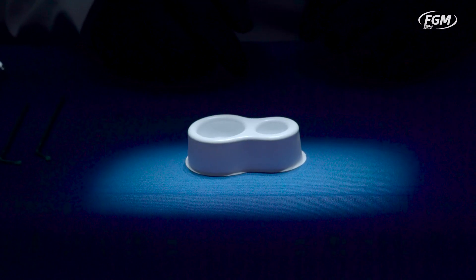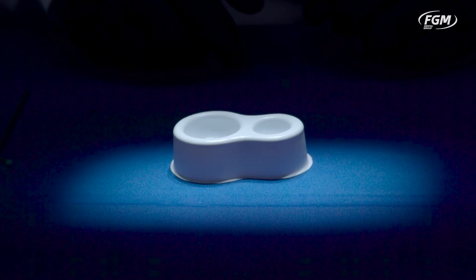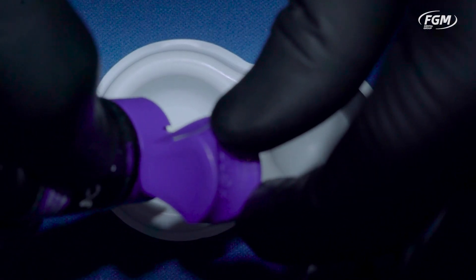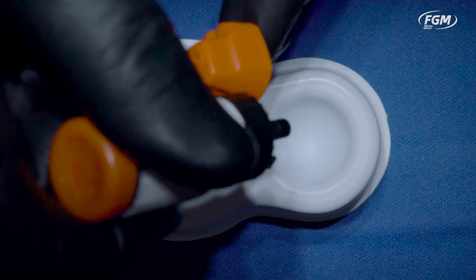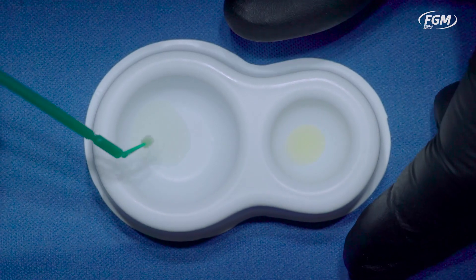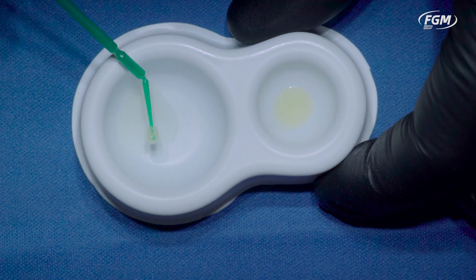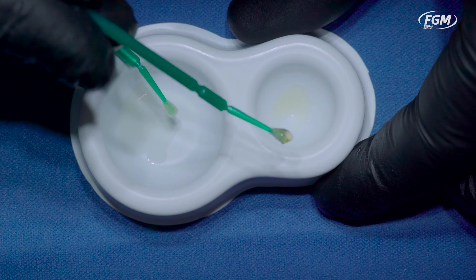Now we're going to demonstrate the effect of APS technology on the color of adhesives. We have a drop of APS, and in sequence, we're going to add a drop of another well-known adhesive on our dispensing well. As you may see, one has a transparent color — APS — and the other one has quite a yellowish appearance.